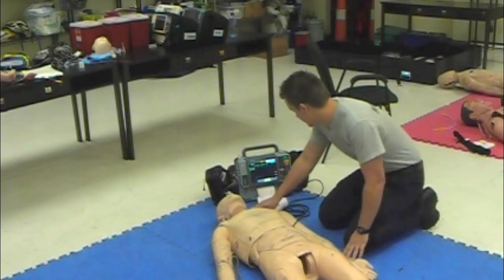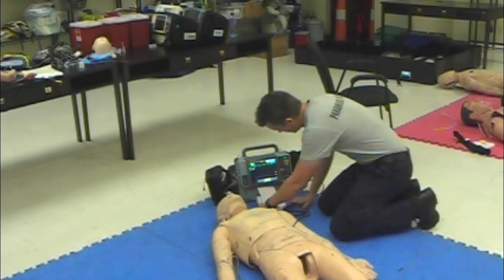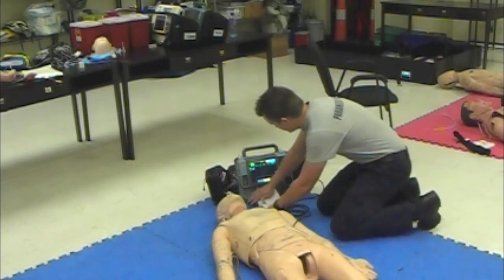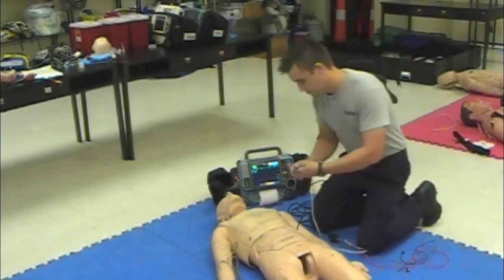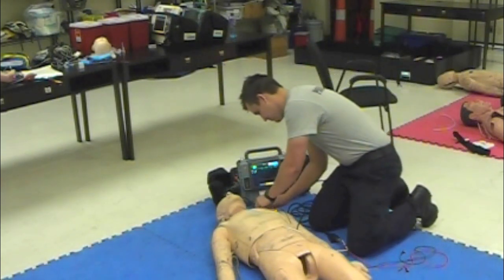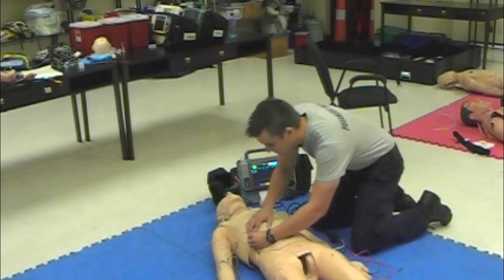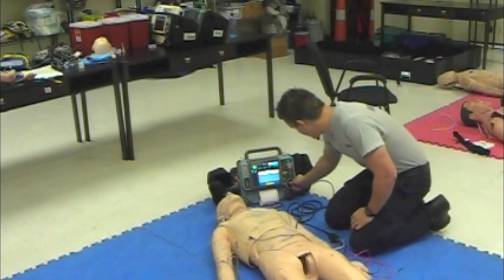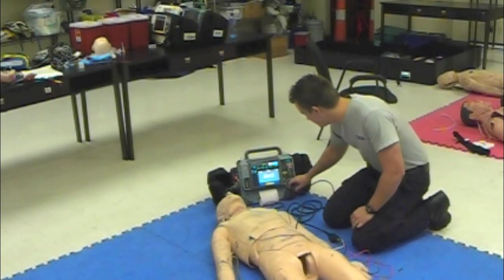And do I have a pulse with this? You do. Okay, can I get a blood pressure real quick? Blood pressure is 60/30. Okay. I see a 3rd-degree heart block. Okay. So I'm going to pace him. I'm going to hook him up to the monitor, and we're going to put him back into lead 2. Okay, we're going to hit the pacer, 70 beats per minute, and we're going to crank it up until we get capture. And I got capture right there, so we're going to set it right there.